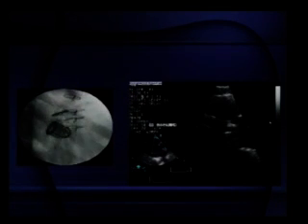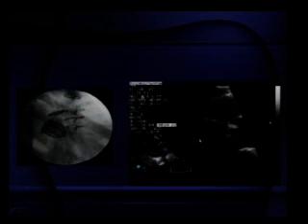Now, this was not the forum to talk about it, but generally Dr. Jamate will tell us, at some point prosthetic valve assessment by echo also becomes extremely important, because once you have subjected the patient to surgery, he is going to come back to you, and prosthetic valve echocardiography is another topic. Here he is showing you two valves on fluoroscopy, and you can see the aortic valve in position so clearly here. This was a Starr-Edwards valve and a bileaflet valve.